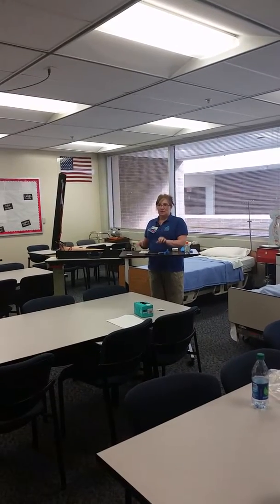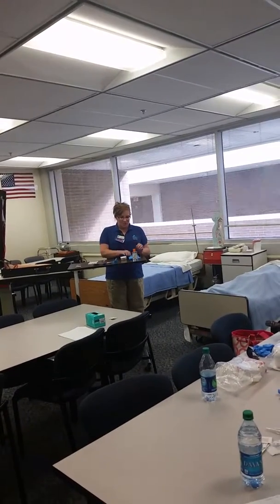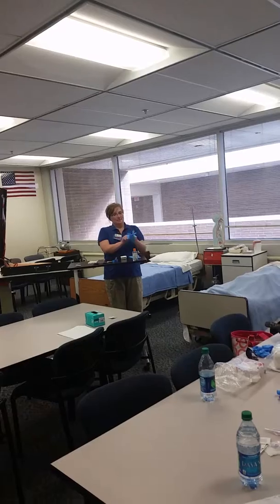I would choose my gauge of needle. It's going to be a 20 gauge based on what the doctor has ordered and what he needs. Now I'm going to prime my tubing. So I do hand hygiene, put on gloves.